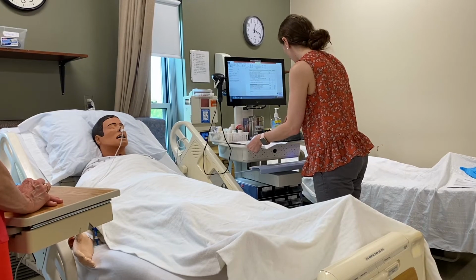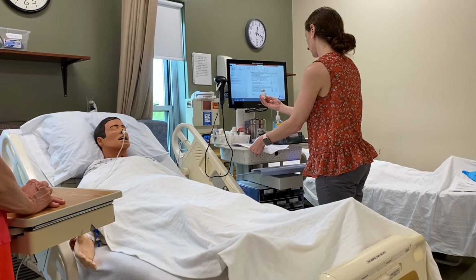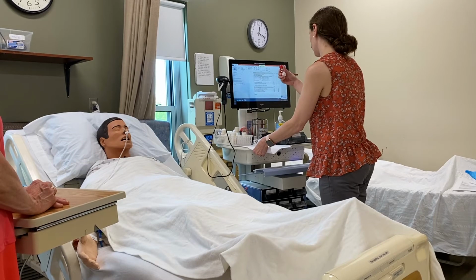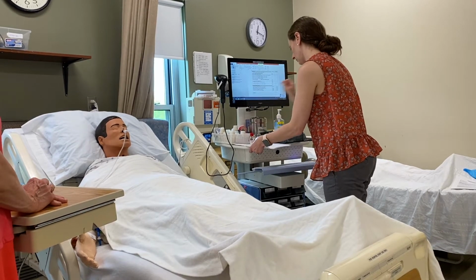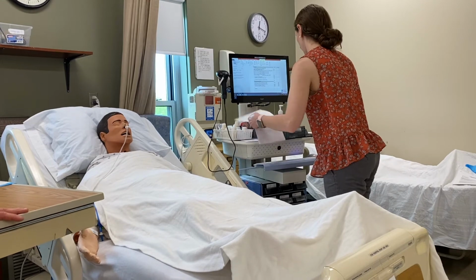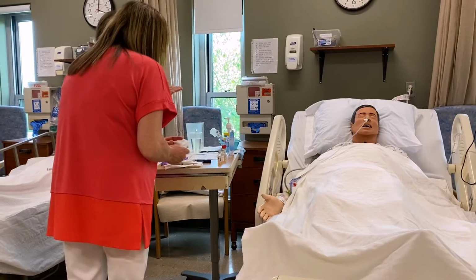Okay, I'm going to be giving him his influenza vaccine, 0.5 mLs, and his Solumedrol steroid, which I will need to reconstitute. And maybe you want to come over here so that he can see how you prepare. And I will bring the syringes over, the syringes are right over there for you.